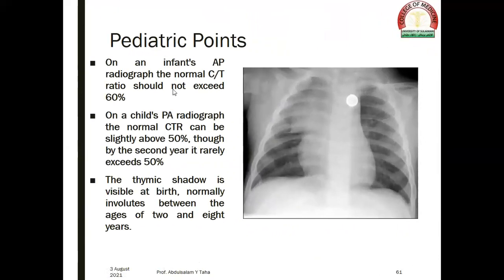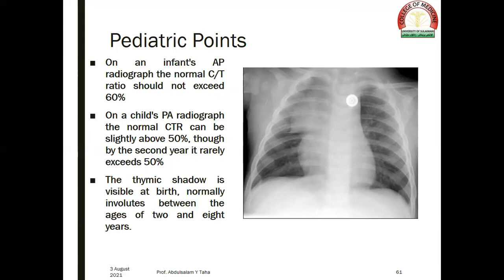In pediatric patients, on an infant's AP radiograph the normal cardiothoracic ratio should not exceed 60%. On a child's PA radiograph it can be slightly above 50%, though by the second year it rarely exceeds 50%. The thymic shadow is visible at birth and normally involutes between the ages of two and eight years. The mediastinal enlargement in this patient is due to a normal large thymus in an infant.